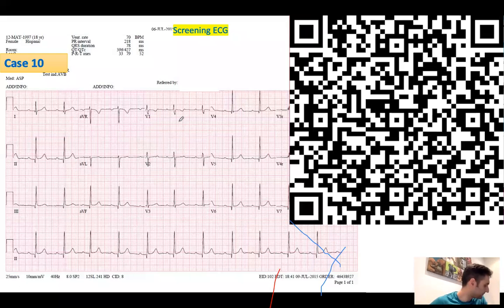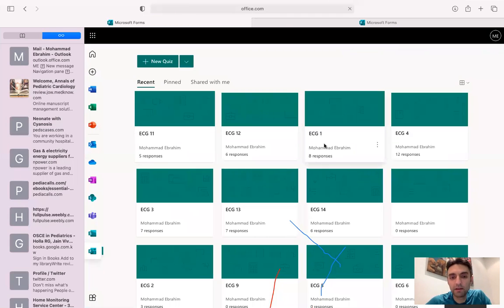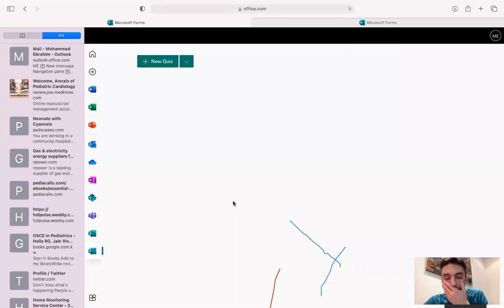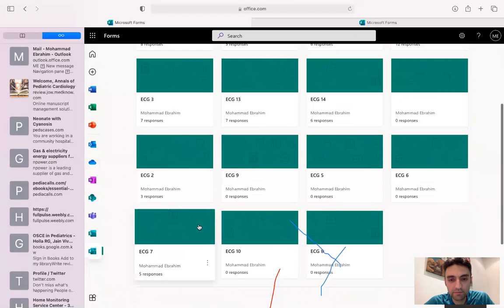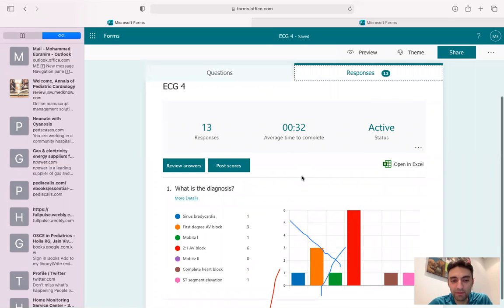Okay, yalla. Okay, ECG 4, where are you? Sorry, wrong. ECG 4, where are you? Okay, mashallah, 12 responses. Okay, good. First time 12, 13 responses. Everyone responded. It's a mixture of answers.